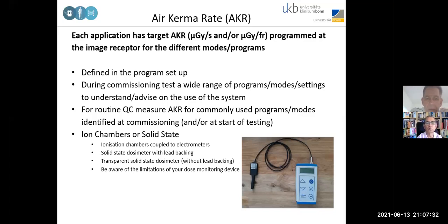For the measurement, you should use either an ion chamber or a solid state chamber. As an example, there's an image in the lower right. Be aware, look at what your ion chambers are actually capable of measuring. What kind of dose rate range can they actually measure? Be aware of the limitations.